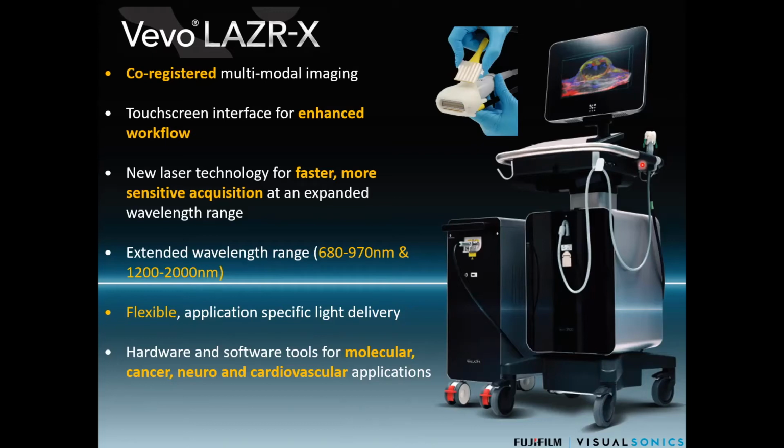And also the data expertise is versatile, so dedicated groups really work into the image processing and image analysis to even get more out of the images than what I could show you today. So the goal is in vivo imaging, non-invasive, to get molecular information, and subsequently at the end of an animal study to guide histology, like which section to take, how to embed the tissue, where to cut, which is also quite a significant time saver.